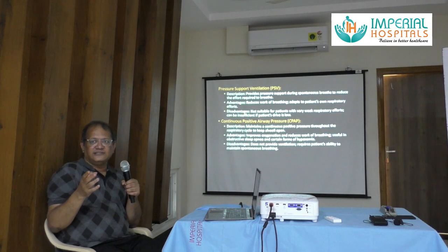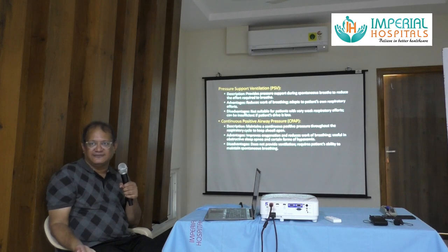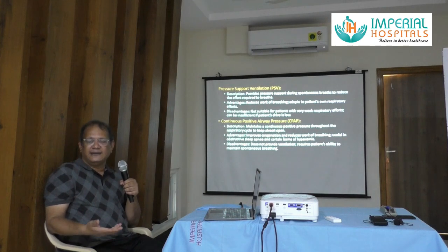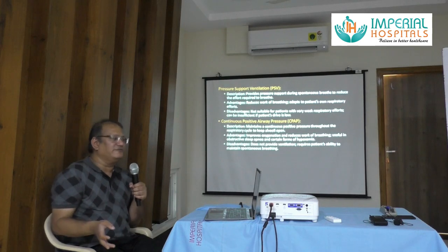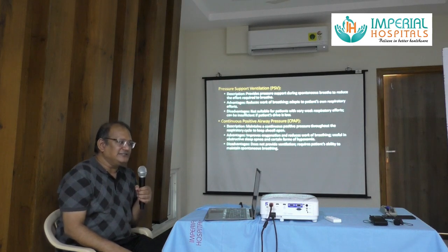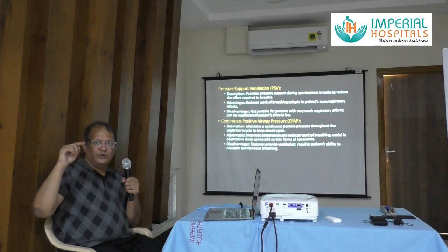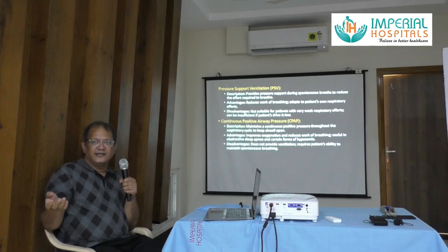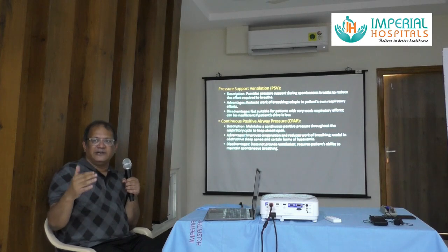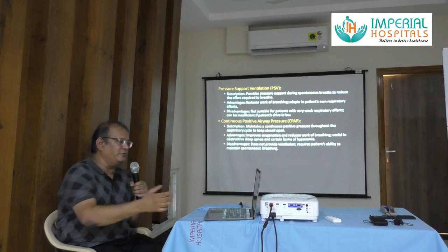So the advantage is, because most of the work you do, inhalation is active, exhalation is passive. So when you are breathing in, additional pressure support will help you take the breath in easier. So that will reduce the work of breathing. Disadvantages is it is not suitable for patients with weak respiratory efforts because you have to set a trigger, right? If it is not triggered, if the respiratory drive is low, it will not be able to help with initiating a new breath.